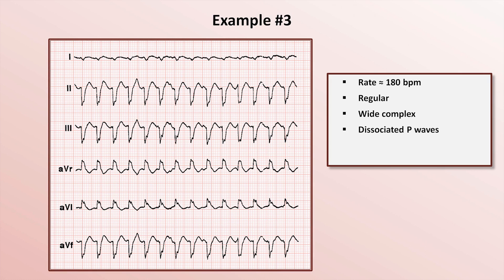Summarizing our findings: we have an unusually rapid, regular, wide-complex tachycardia with dissociated P-waves. We can be very certain this is ventricular tachycardia — specifically the monomorphic subtype.